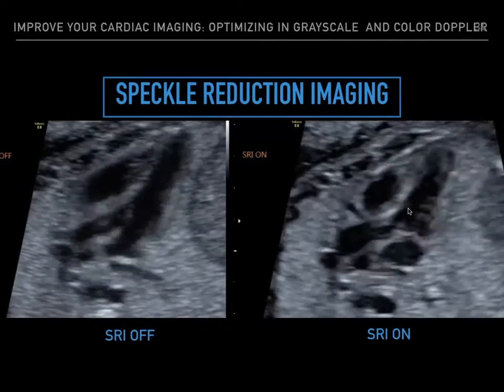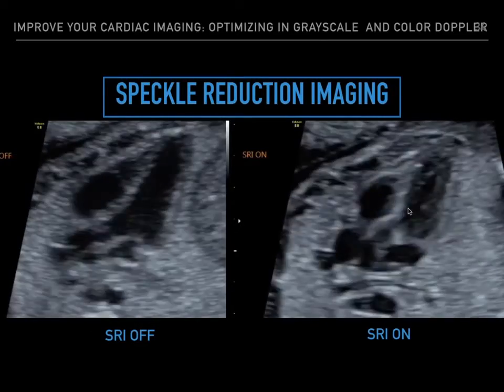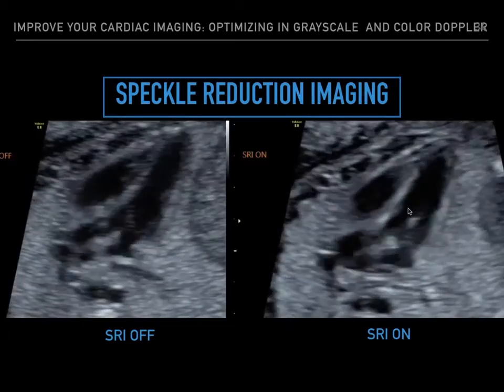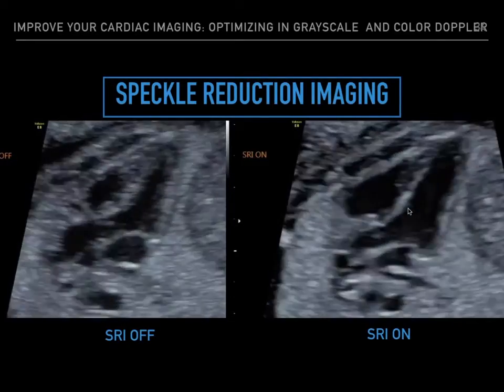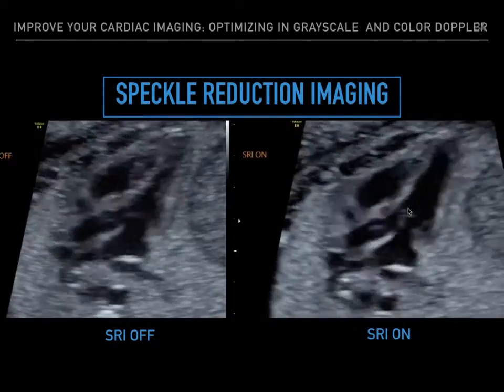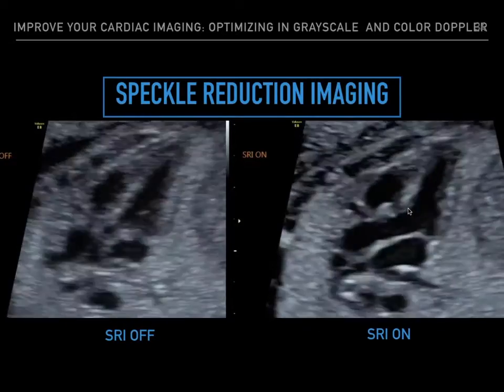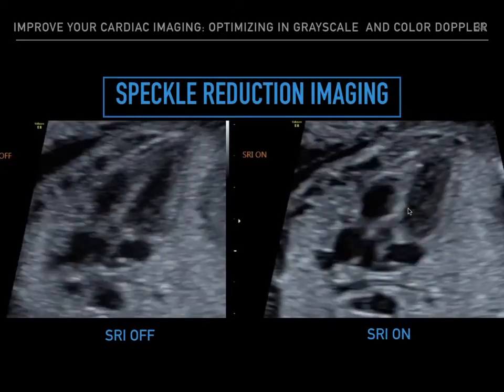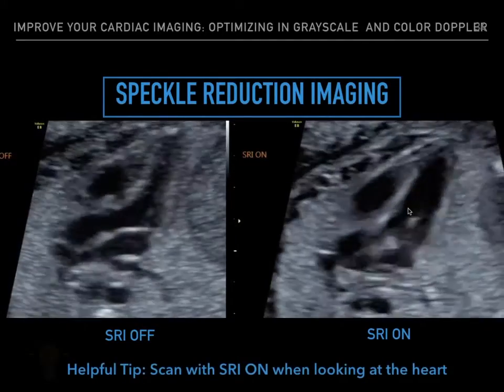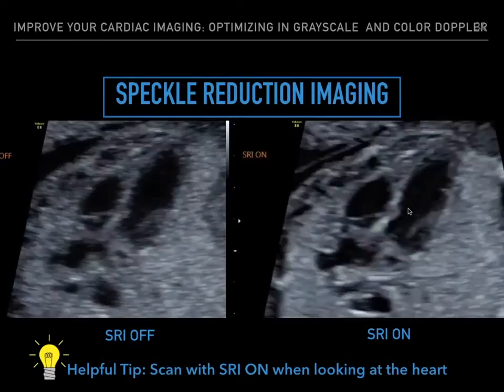So here's an example of speckle reduction imaging off and on, and we are looking at the left ventricular outflow tract. With SRI off, it's almost like we see some striations along the interventricular septum that makes you think, well, is there a suspected ventricular septal defect in that area? But when you turn SRI on, you could see the smooth, nice walls of the interventricular septum. So helpful tip, you want to scan with speckle reduction imaging on when looking at the heart.